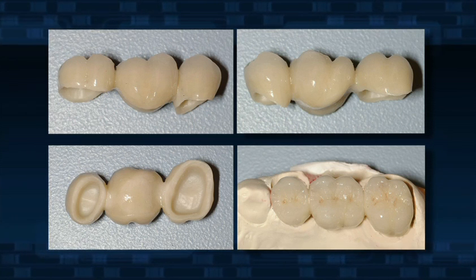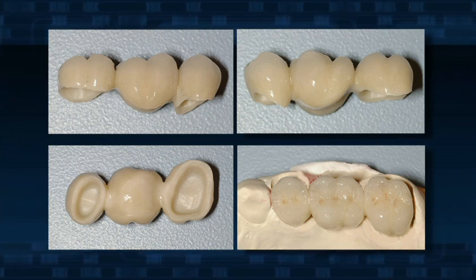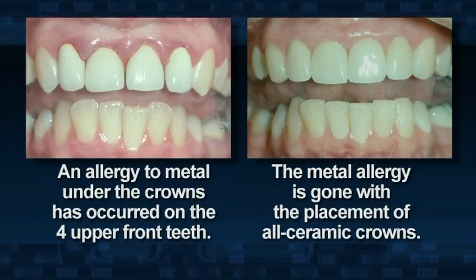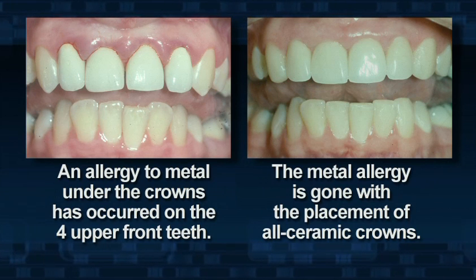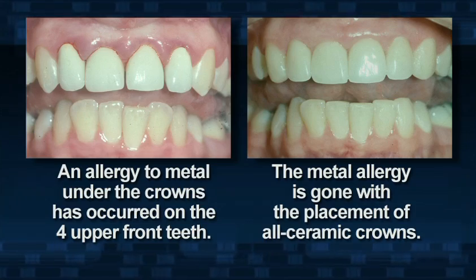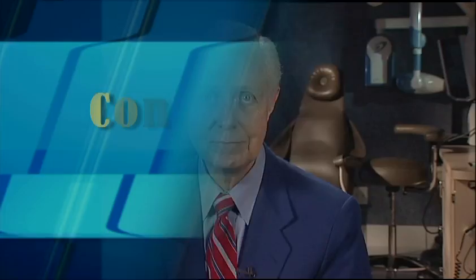This type of fixed bridge is growing in popularity, but it is not as popular as porcelain-fused to metal bridges. Your dentist may suggest an all-ceramic bridge if you have metal allergies. Additionally, some types of all-ceramic bridges may have slightly better aesthetics than porcelain-fused to metal bridges. Some all-ceramic bridges are weaker than porcelain-fused to metal bridges. However, zirconia-based all-ceramic bridges rival porcelain-fused to metal bridges in strength and beauty. Ask your dentist about them.